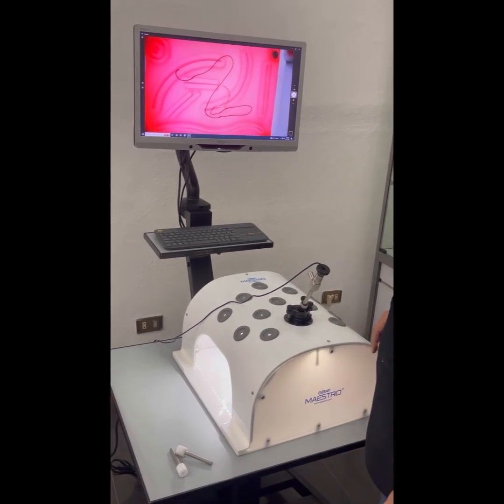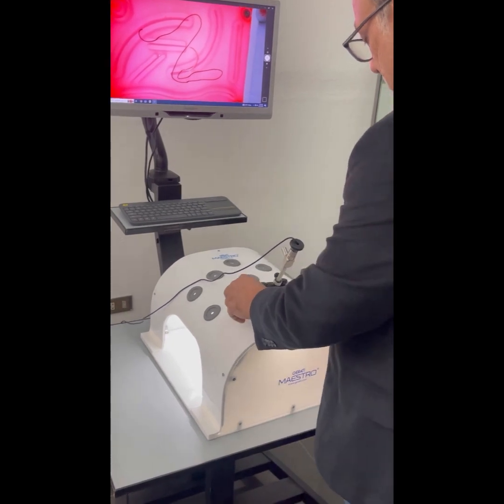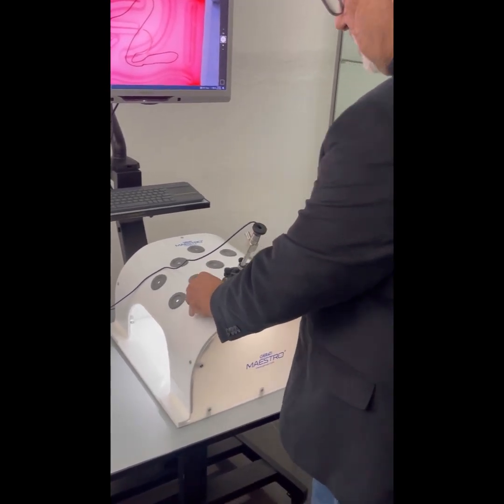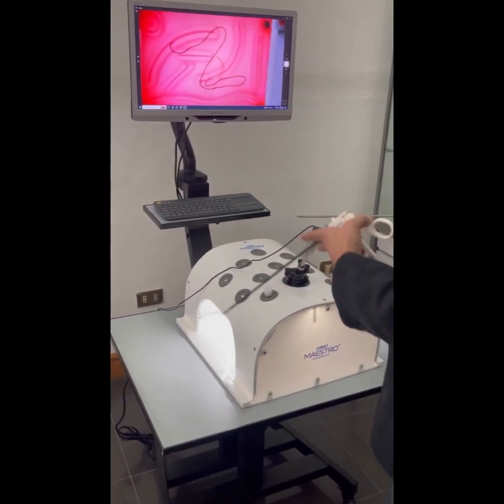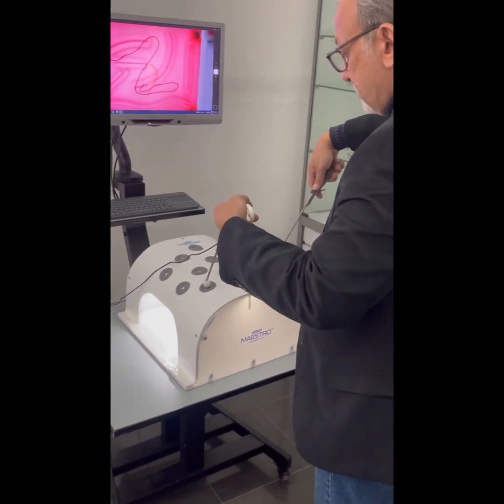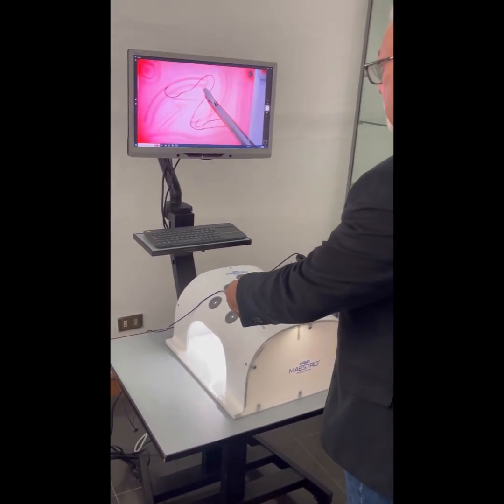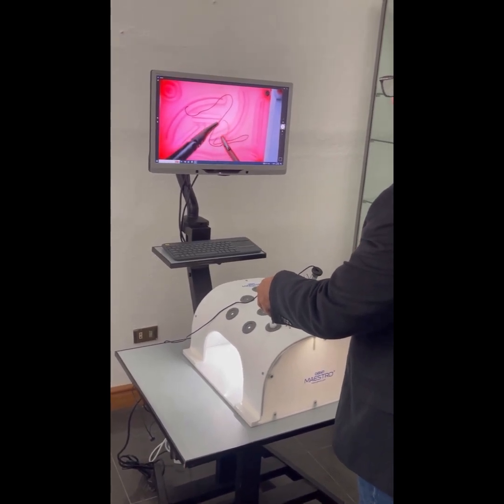Once the training task and camera are in position, dummy trocars are inserted in any desired instrument insertion ports. Then a needle holder and another instrument are inserted through the ports inside the trainer, and you can begin your training procedure.